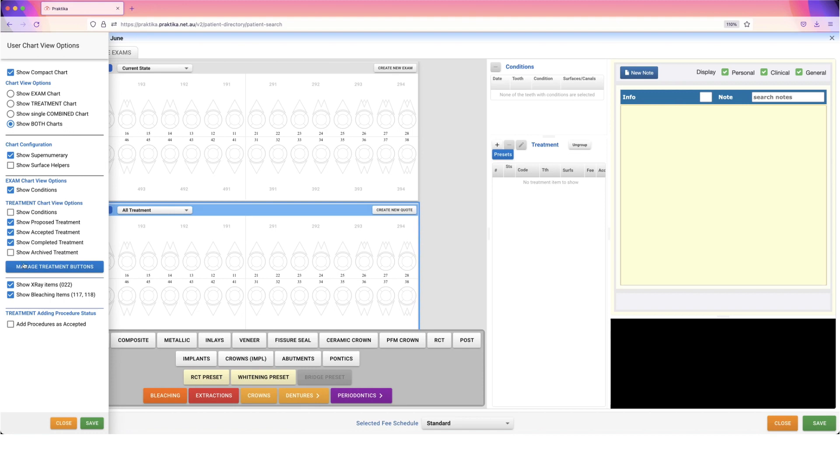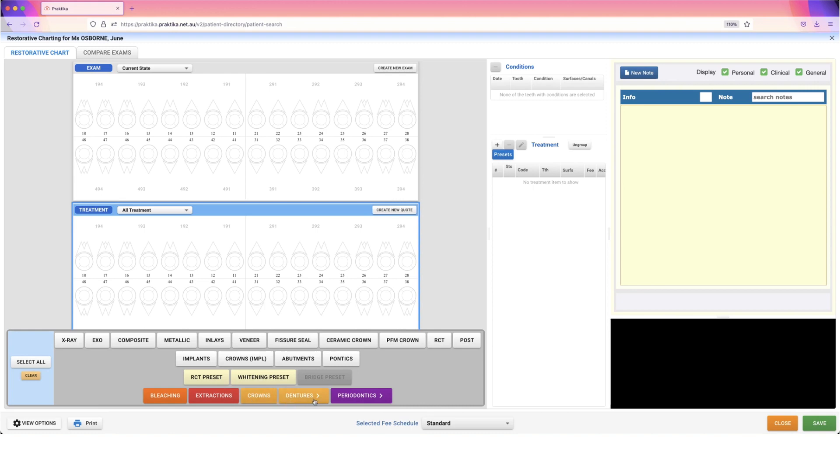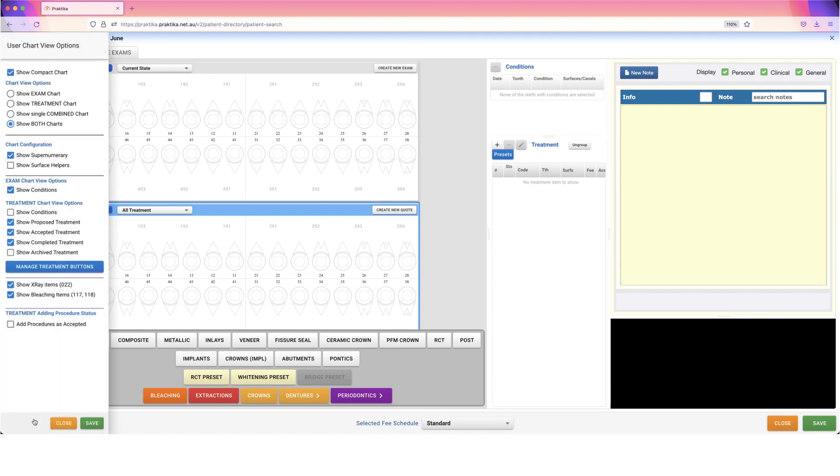Now I'll show you the Manage Treatment Buttons option. This refers to these options at the bottom of the screen for our treatment chart. At the moment, we have a very standard charting view with pretty much everything in place, and these options at the bottom you can select to get further options available.